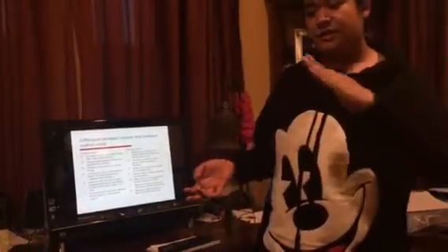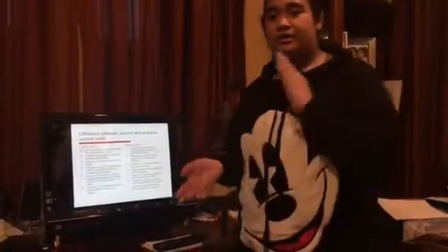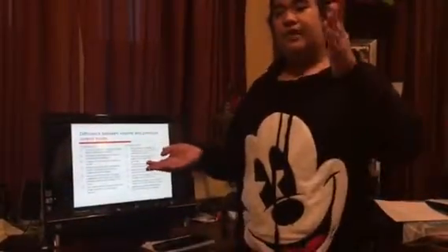For the waveforms of both, volume will show a shark fin for its pressure, because it's just slowly increasing while the volume is being achieved. For pressure, the waveform is more of a square, so it's just shooting up to that set pressure and maintaining that pressure for quite some time, or until exhalation is ready to be done.